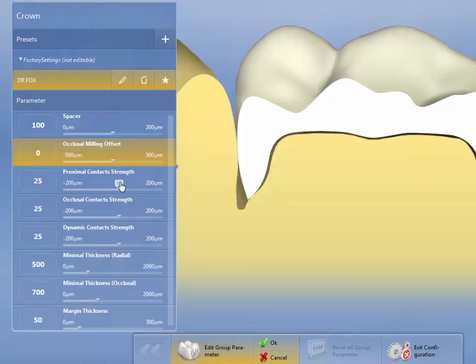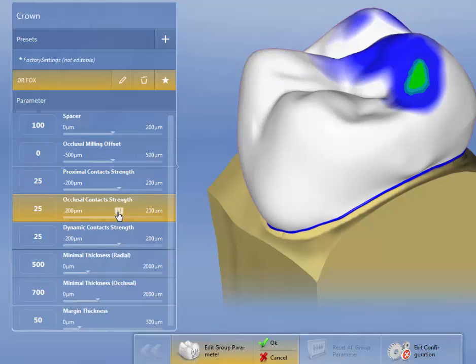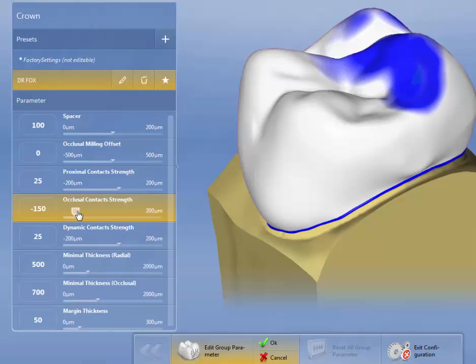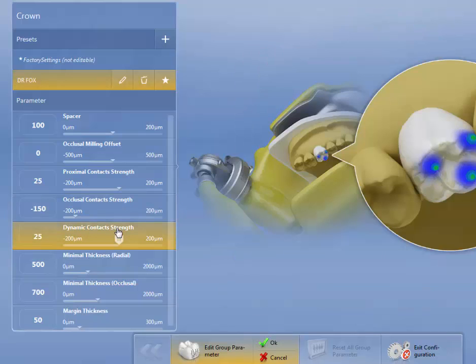Proximal contact strength. I normally leave the default factory setting of 25 because as you'll see as we go along, we'll adjust the contact strength for each restoration. Occlusal contact strength. Now, because it doesn't take into effect the periodontal ligament, what I normally do is I'll set this to minus 150, because the compression of the periodontal ligament is about 75 microns on both the top and the bottom.